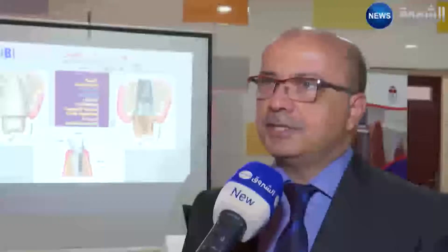Notre méthode se résume à une ouverture circulaire de quelques millimètres, nécessaire à la pose de l'implant dentaire, ce qui réduit considérablement le temps de l'intervention sans chirurgie. Cela prend à peu près 5 minutes.